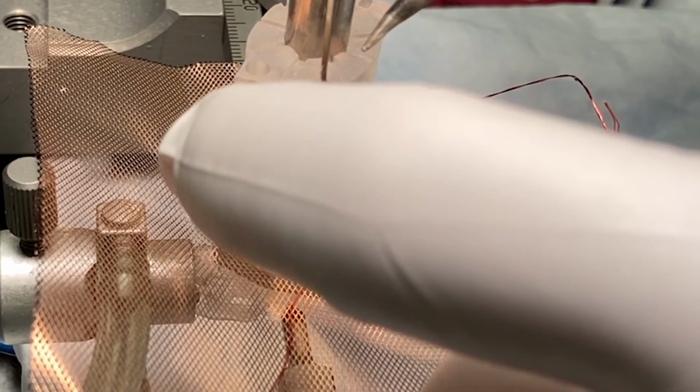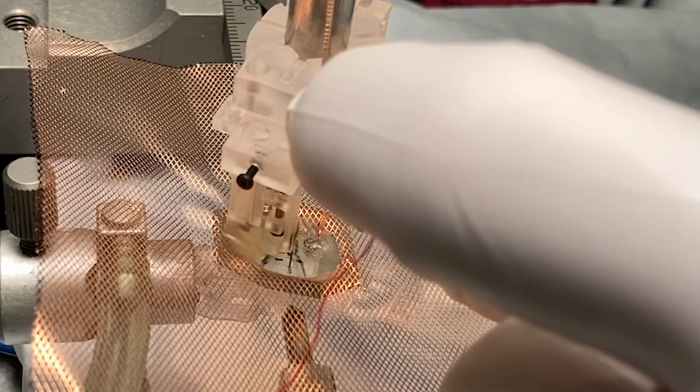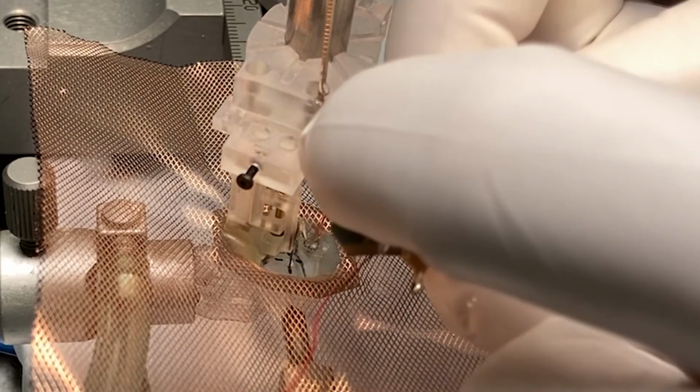Once you have moved away, you can desolder the PCB from your stereotactic attachment. And I personally, again, like to lay down the PCB on the copper mesh where it's not in the way.